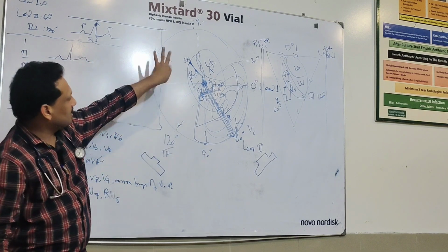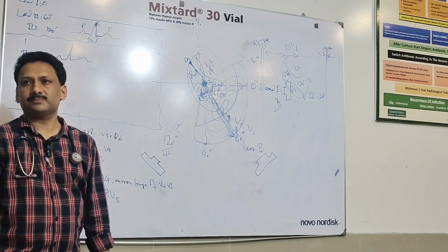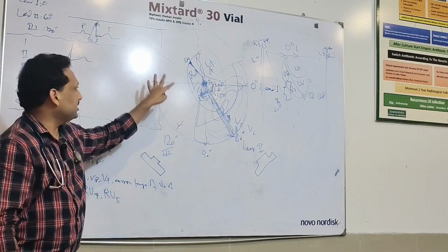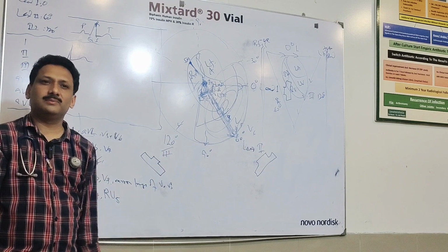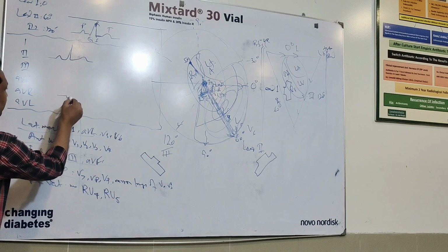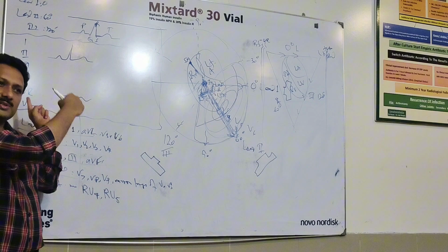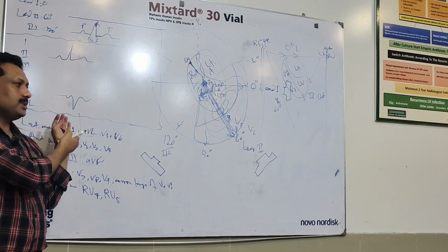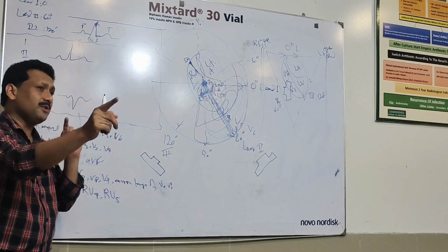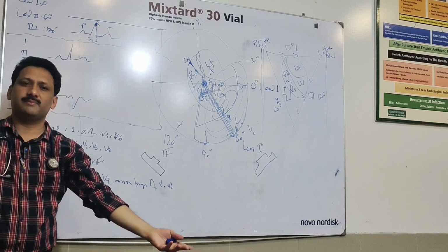Now I ask you another question. Just see this whole illustration, see these degrees. Tell me the name of the lead which is having direction exactly opposite to it. That is AVR. So how would AVR look? AVR all negative. So now you come to know why in ECG, when you see this AVR, it is all negative. So that was the simple interpretation. Direction of flow of current towards that axis, all will be positive. Away from that axis, all will be negative.